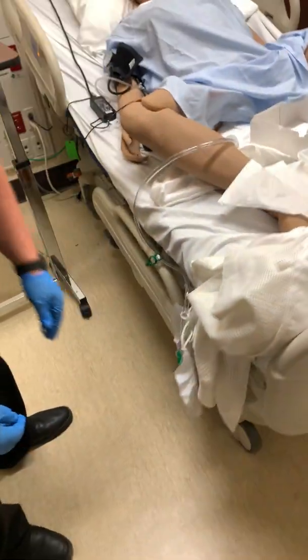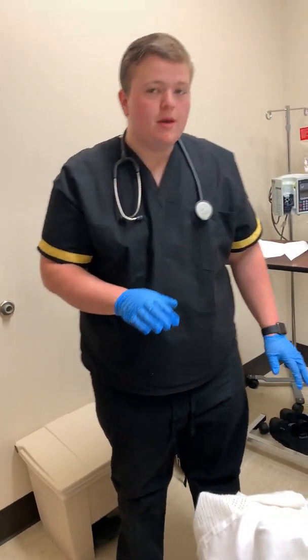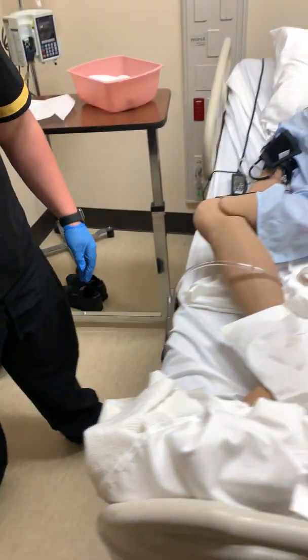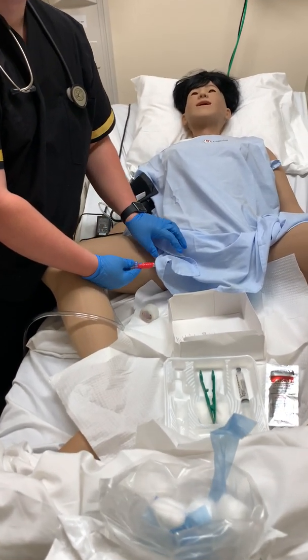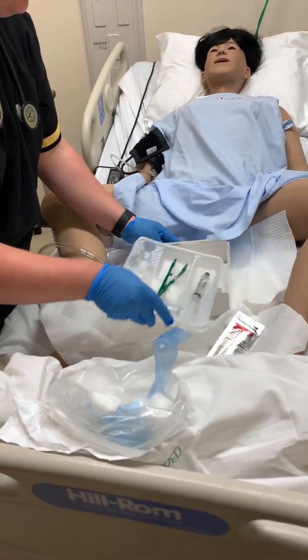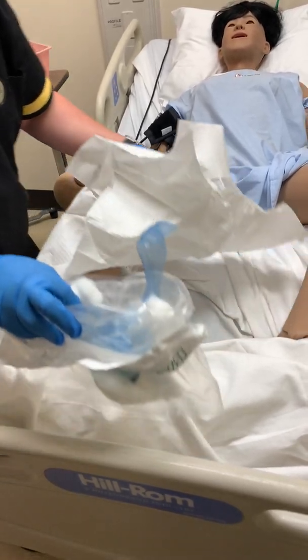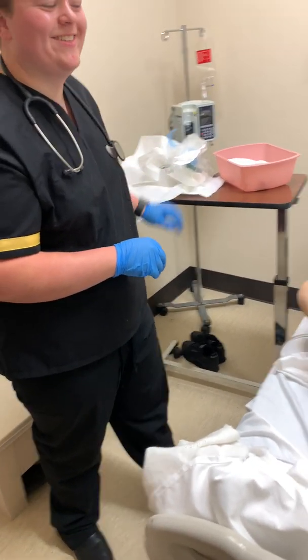All right, and so say the doctor ordered us to collect a urine sample. Immediately after we insert the catheter, we can collect that sample straight from the bag, but later on you don't want to do that. Say later on you want to collect your urine sample straight from here on the catheter. And now we are done with all of these supplies here. You can go ahead and trash everything. That's the trash can. All right.